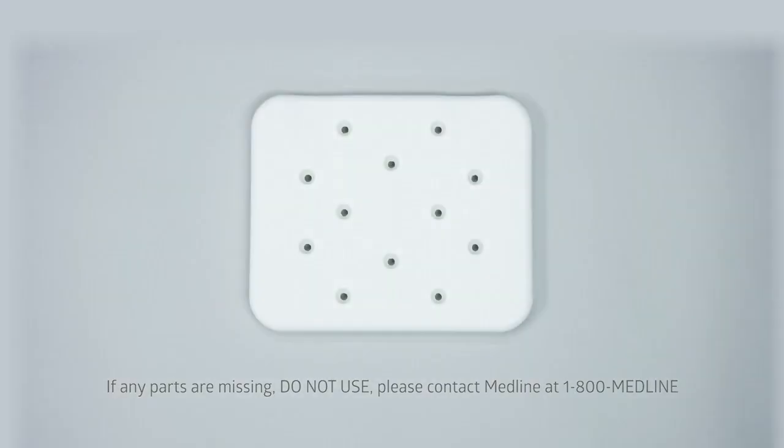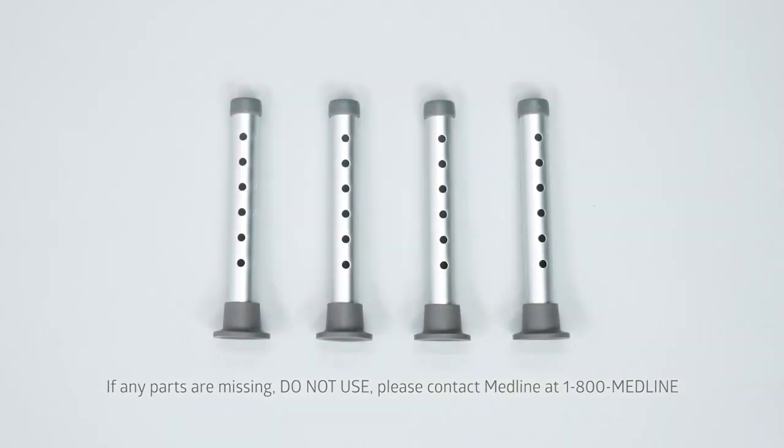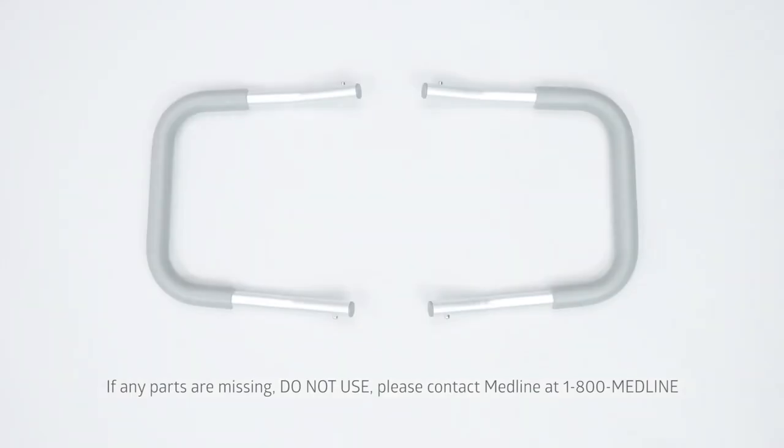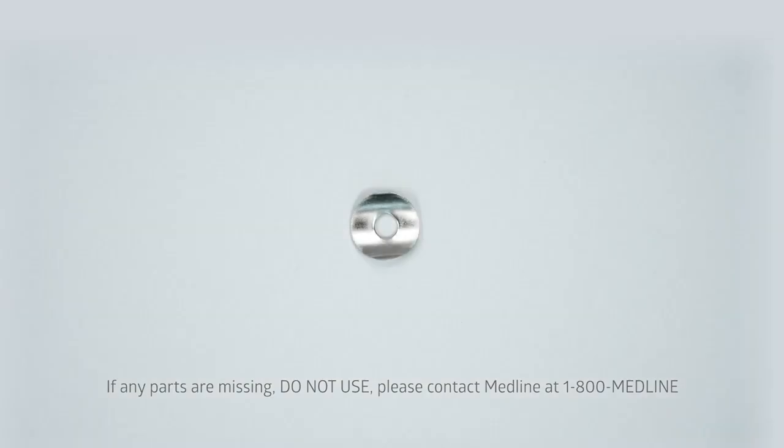Ensure that you have one bench, two aluminum mainframes, four aluminum extension legs, two reinforcement bars, two padded armrests, five hand screws, and one curved washer.